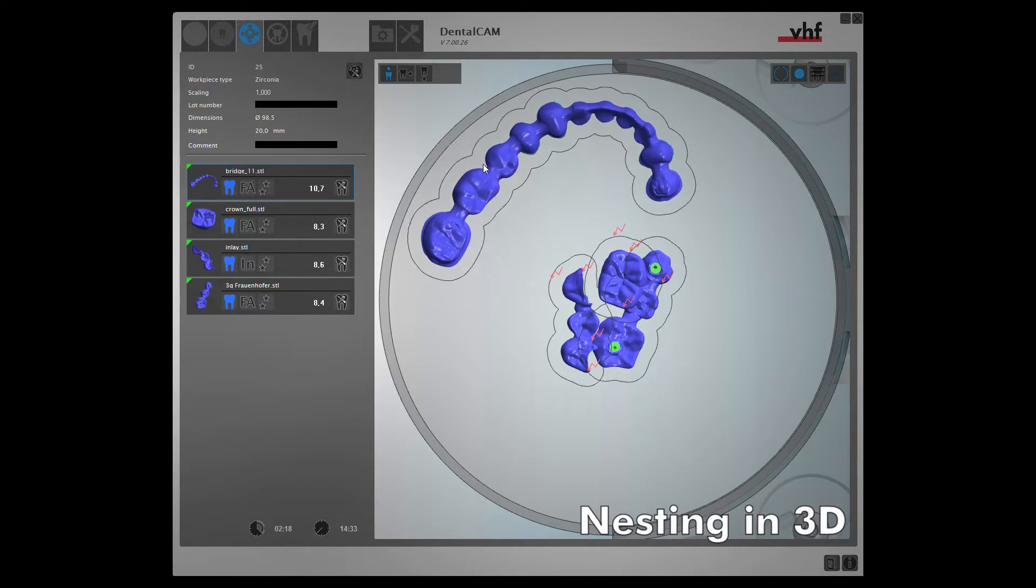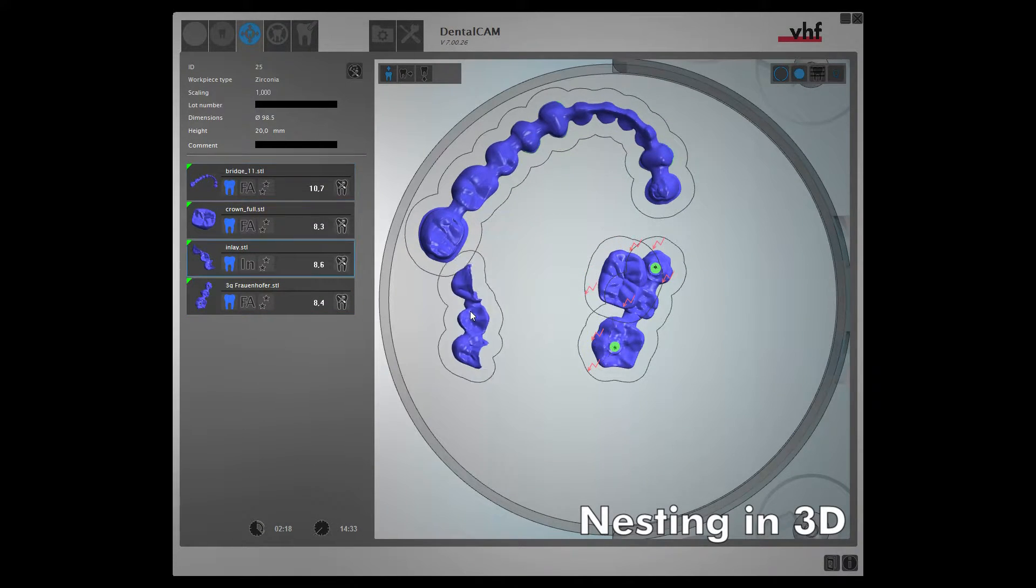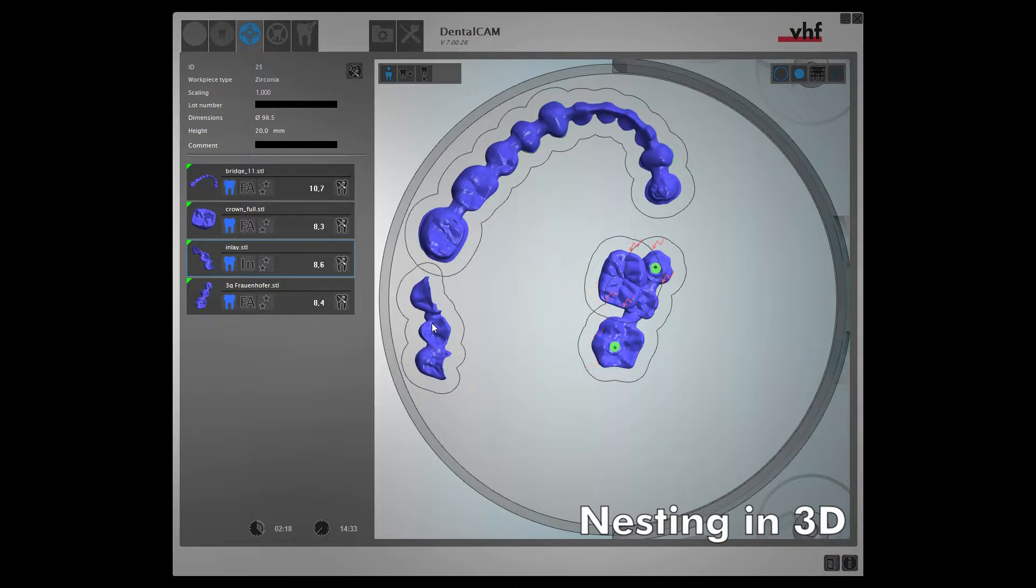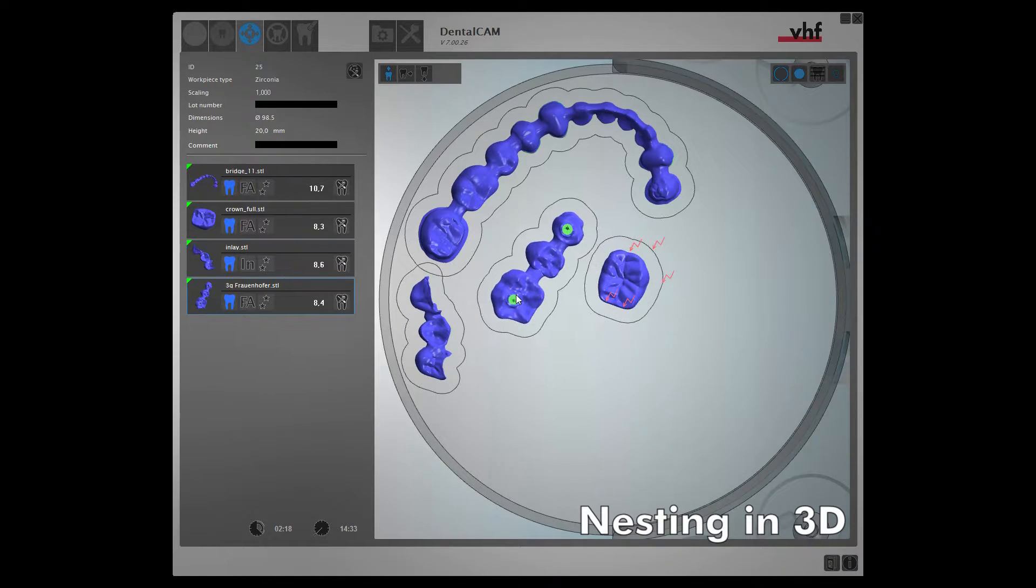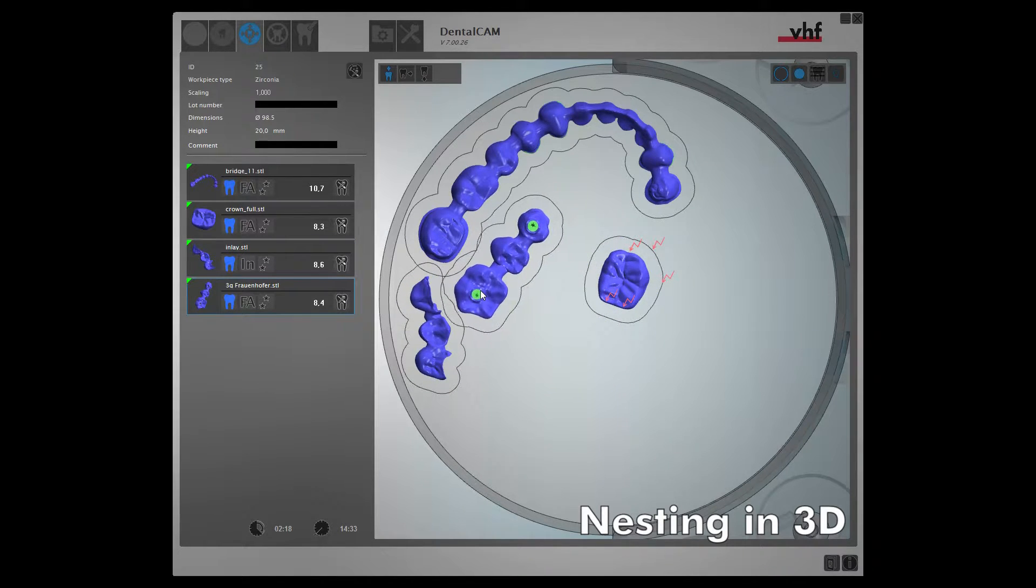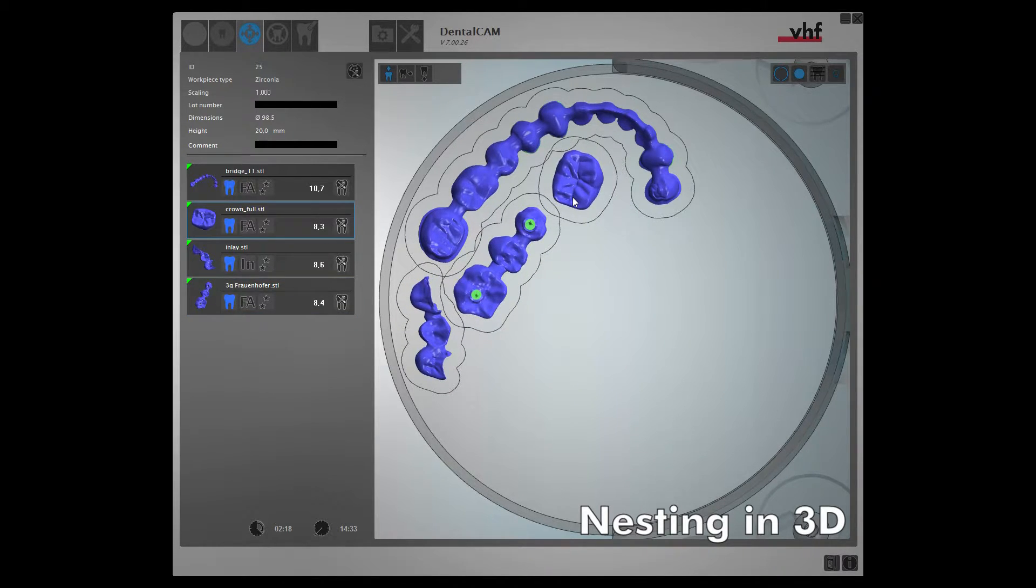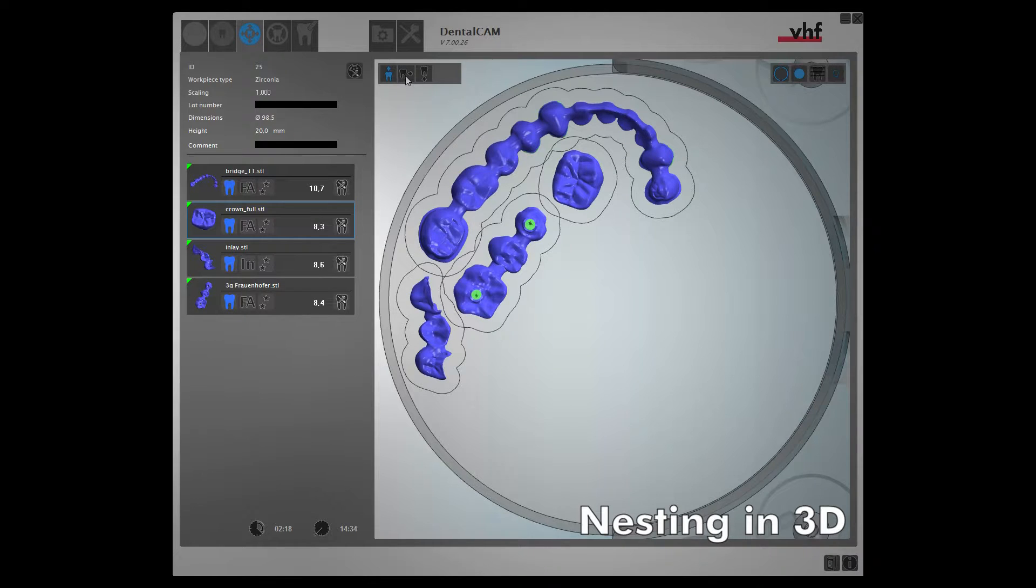Just as before, you can nest your objects from the traditional top view. Or, a simple click will toggle to a more intuitive 3D view.